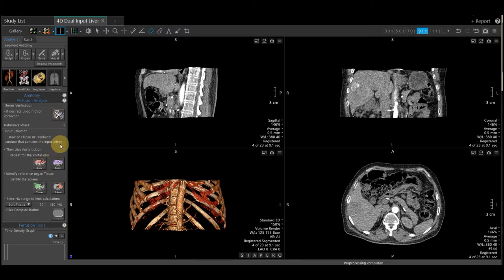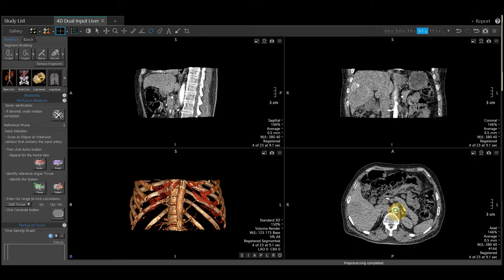To produce your perfusion maps, we have to put four regions of interest on our images. To start with, we begin with the aorta. Come over to your image and make sure your aorta is at the brightest, then hold your left mouse down to draw your region of interest inside the aorta. You do want to make sure it's completely inside the vessel and does not go outside the wall. By holding your left mouse down, you can move it if necessary. Once you draw that ROI, select aorta.